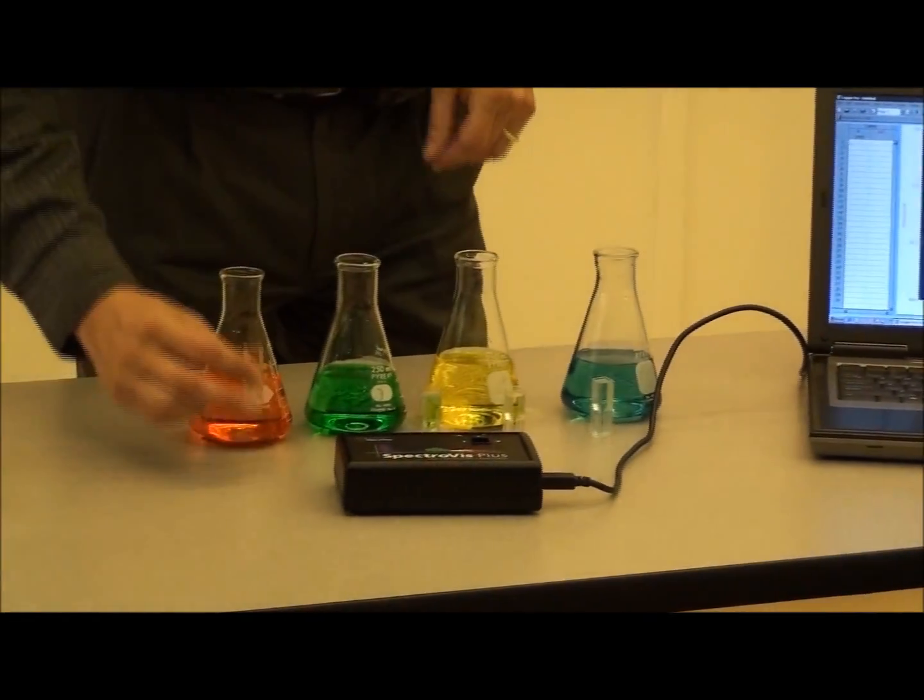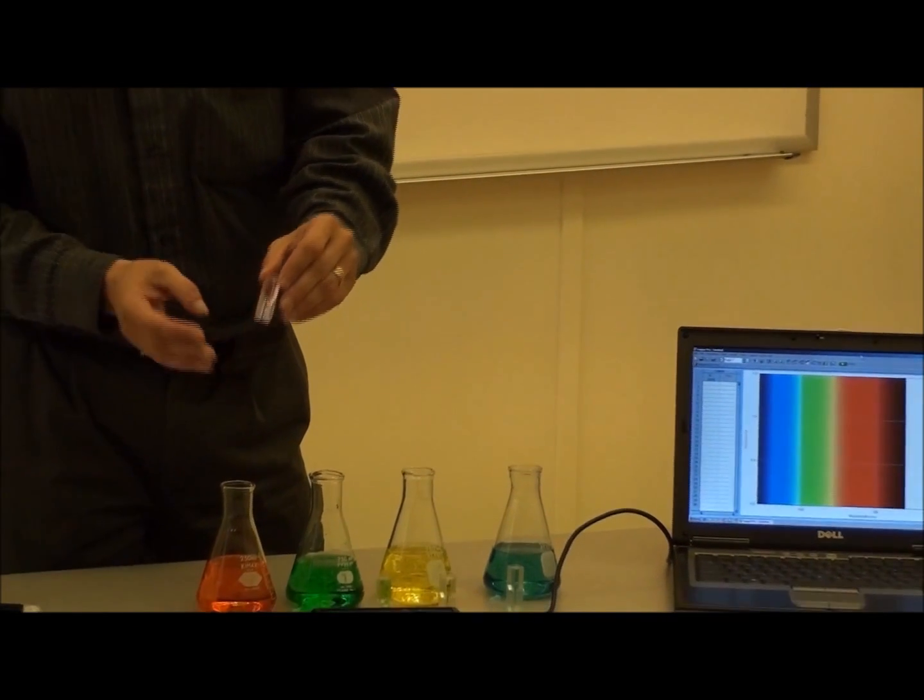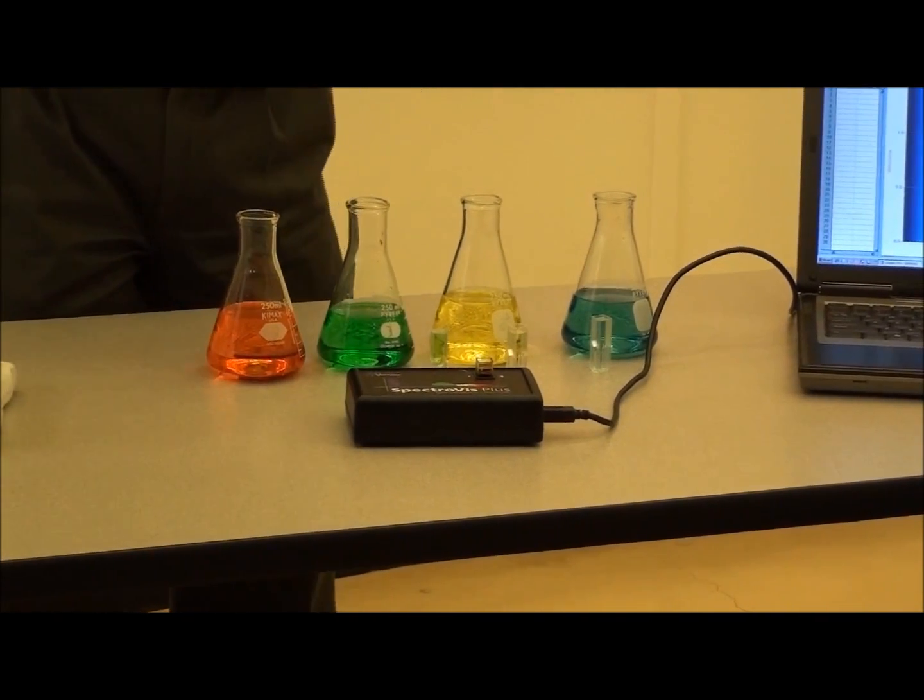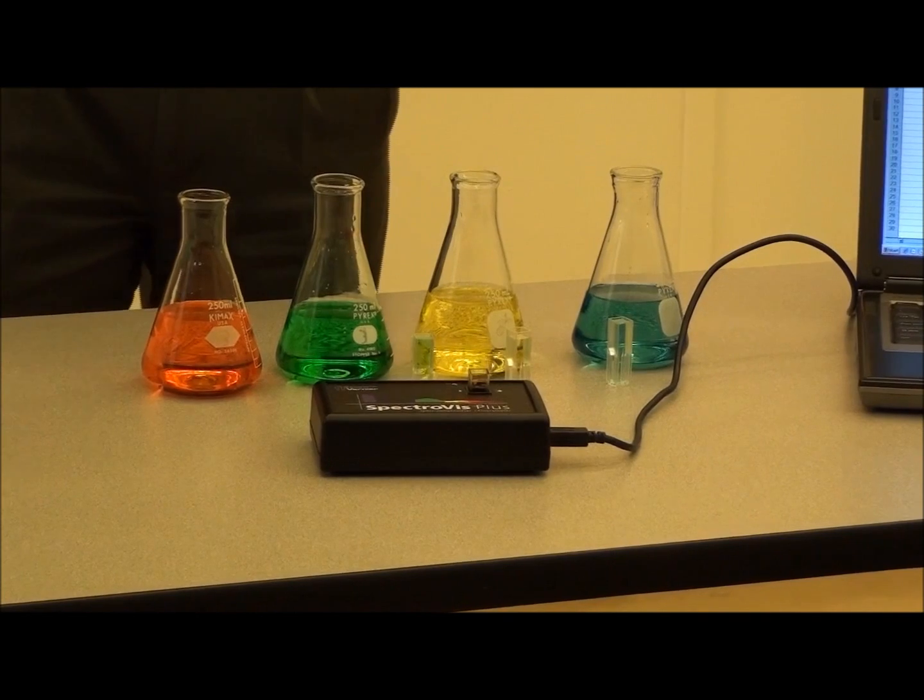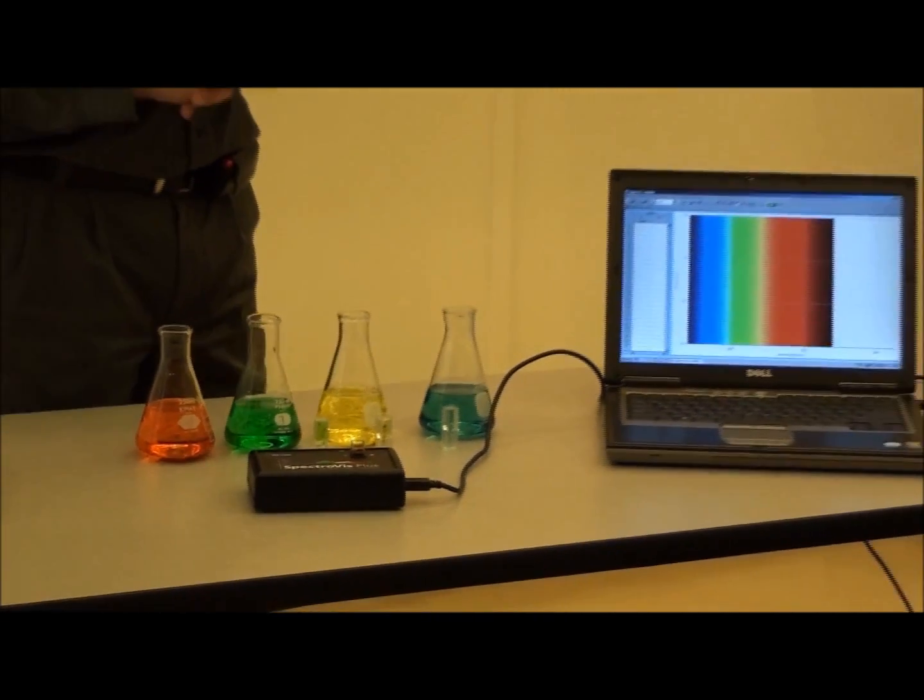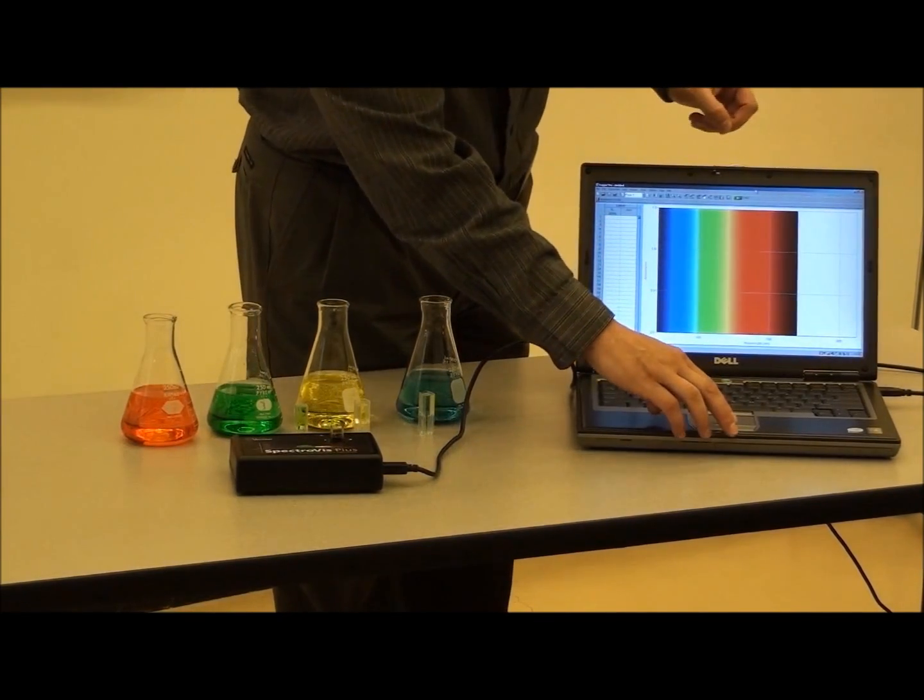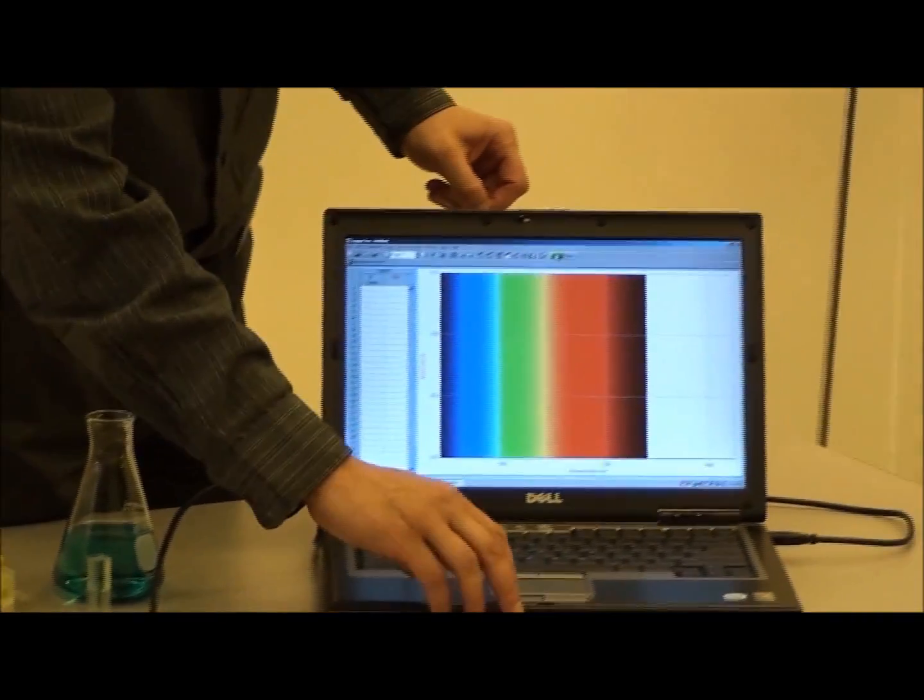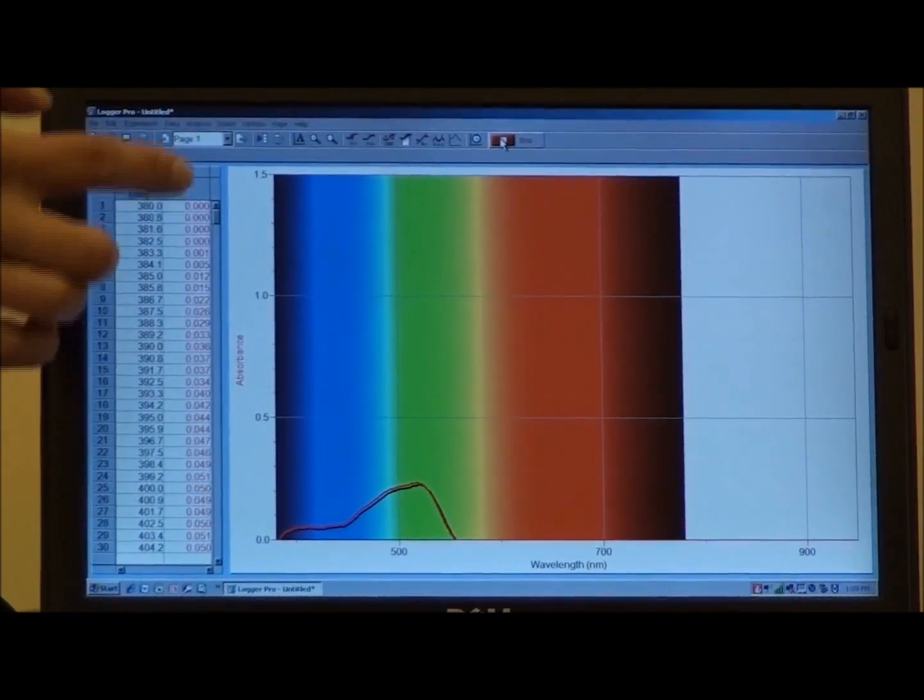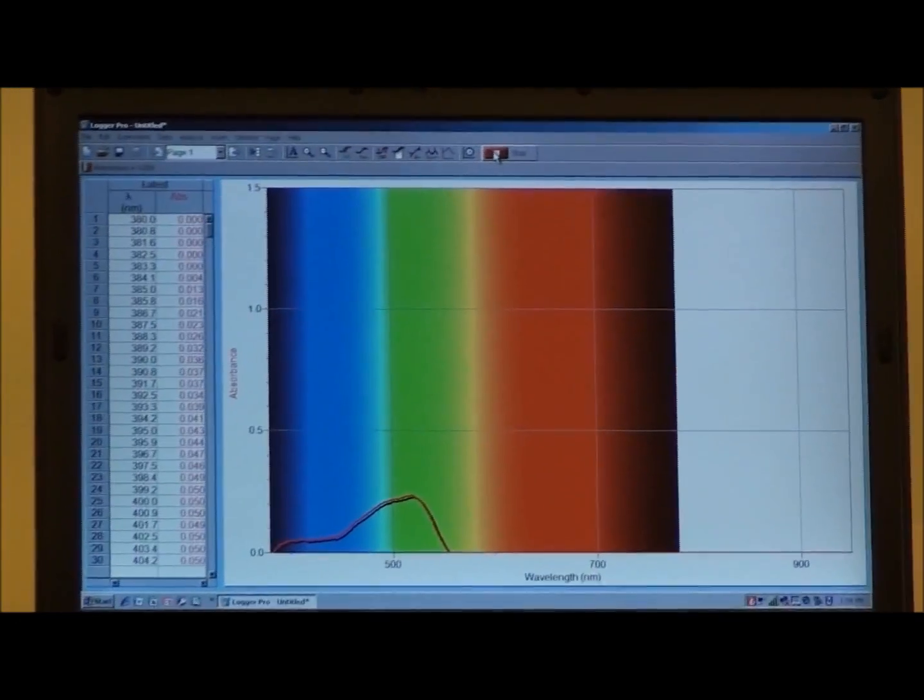Here I have a red solution in a cuvette, which I will now place into the spectrophotometer so that we can measure the absorption spectrum. This particular instrument collects the absorption data for all the visible wavelengths simultaneously. Of course, a pulse oximeter only collects the absorbance data at two wavelengths. I will now start the data collection. We can clearly see the absorbance as a function of wavelength. Note that this red solution strongly absorbs in a region that is not red, but in the blue and green regions.